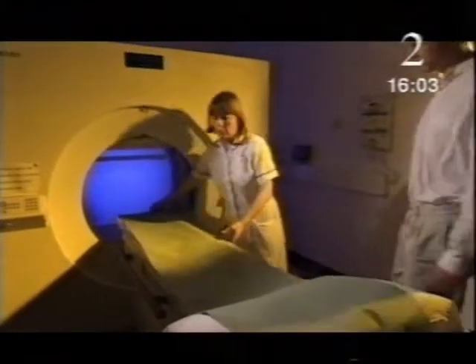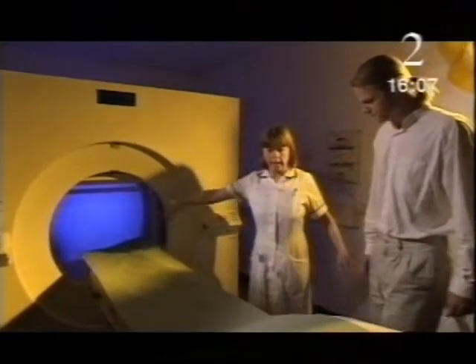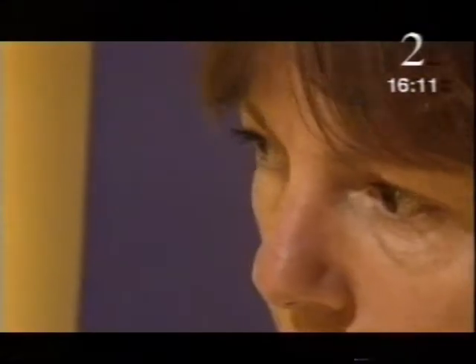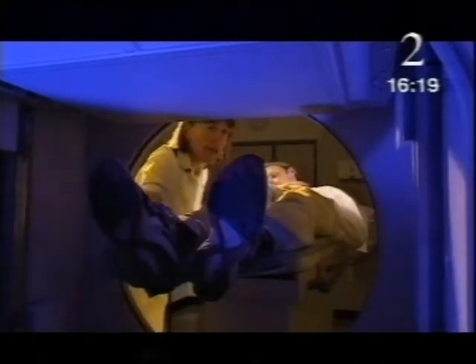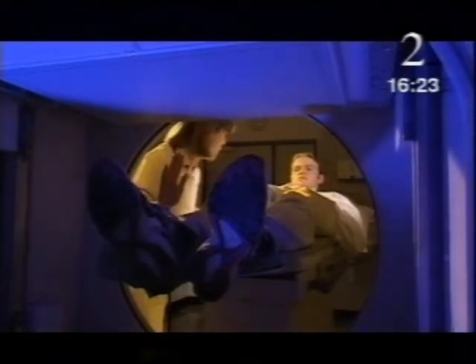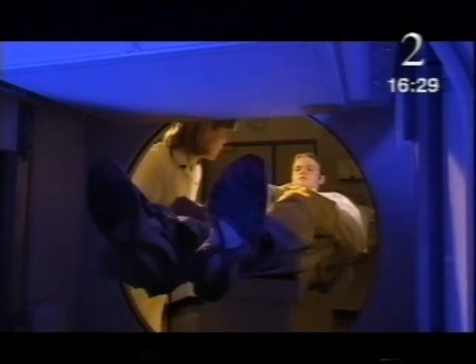Gavin, this is the camera that we're going to be doing the pictures on. Yep. I need you to lie down on the bed, feet that end, head up there, on your back. Right. This is the camera that's going to be taking the pictures. We've got one at the top and we've got one at the bottom, and they're going to be moving around you, taking pictures at different angles all around your body so that we can do a reconstruction in 3 dimensions. Okay?